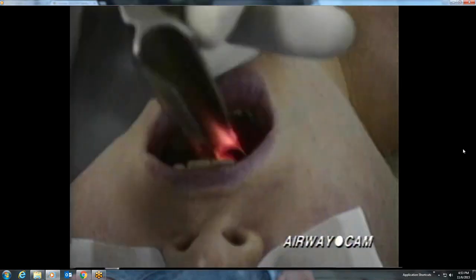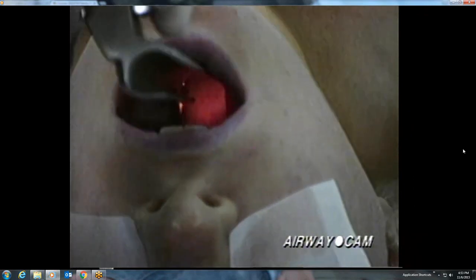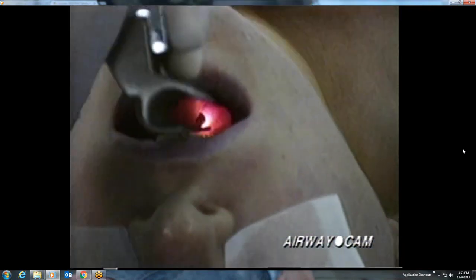The following 3 laryngoscopies with different blades are all on the same adolescent patient. First, let's look at laryngoscopy with the Miller blade. There's a nice view of the posterior pharynx and epiglottis, as well as the round opening into the esophagus.